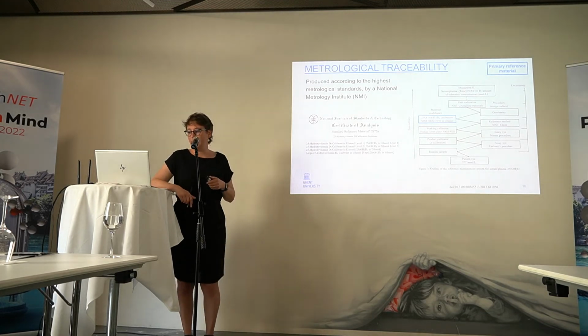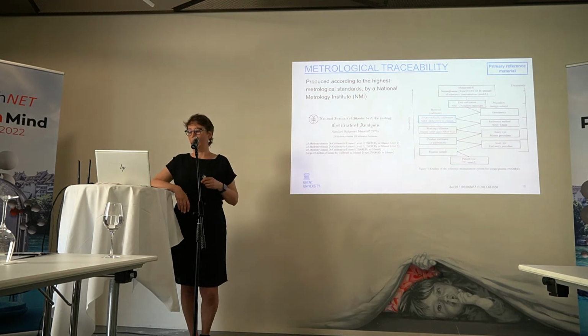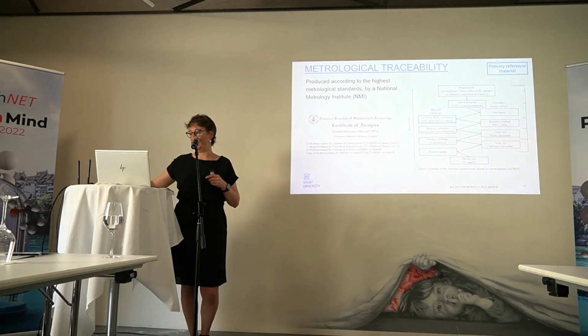So for 25-hydroxyvitamin D, I have just a screenshot of the content. It's D3 calibrator at 2 levels in ethanol, and it also contains D2, and it also contains the 3-epi, which we don't use clinically, but it's contained in the reference measurement material.